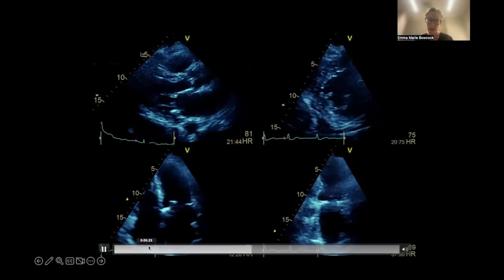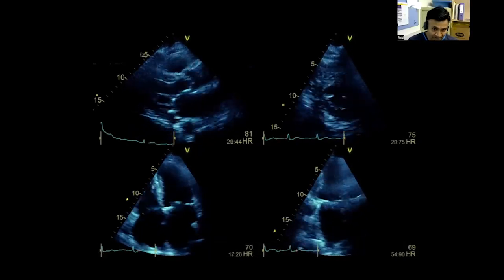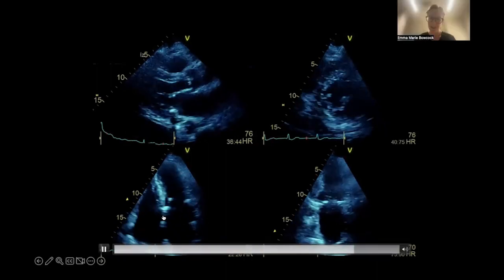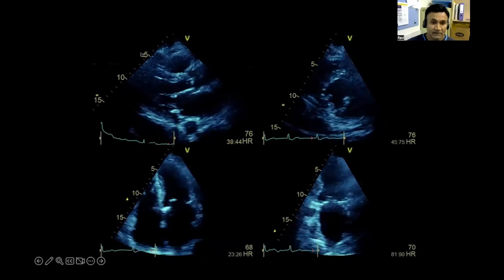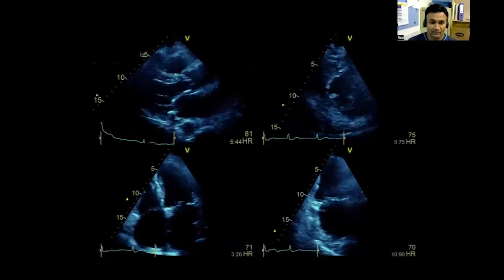Calcification. Yeah. How about the right atrium? Right atrium appears big as well. However, the interatrial septum is still moving onto the right side. So probably elevated left atrial pressure. Very nice. And right ventricular size appears normal on this view.